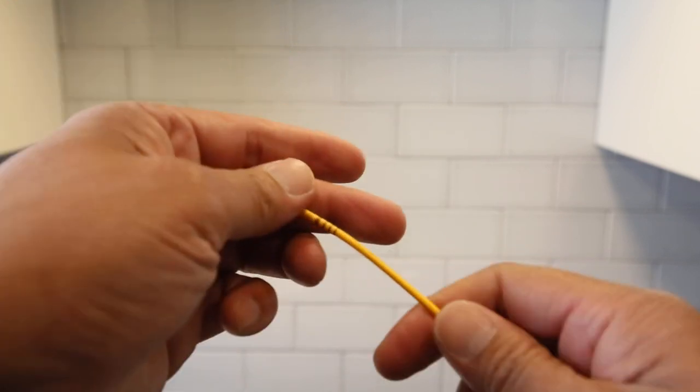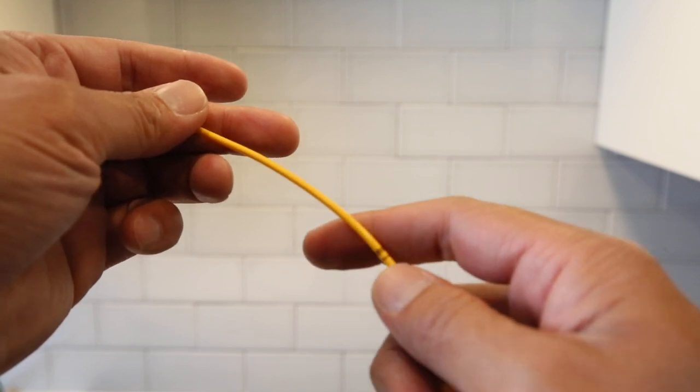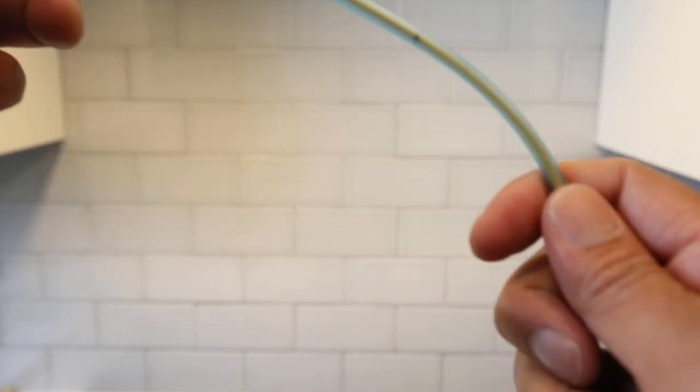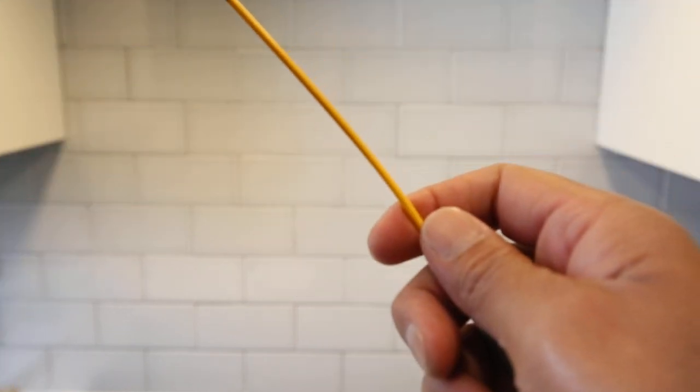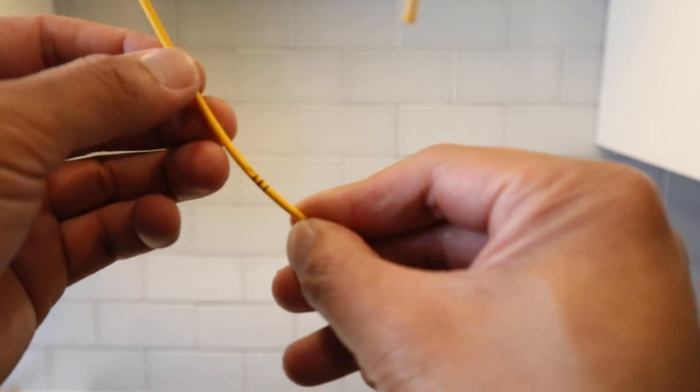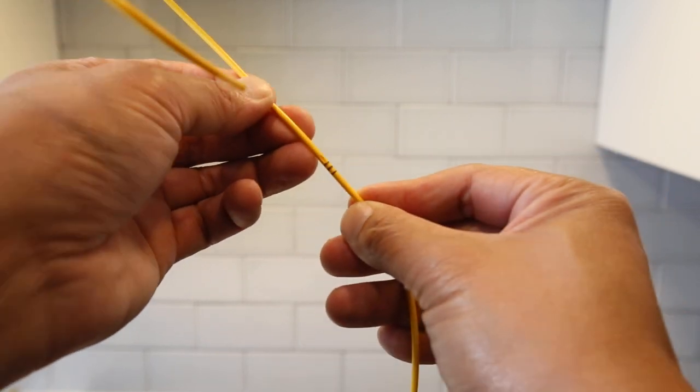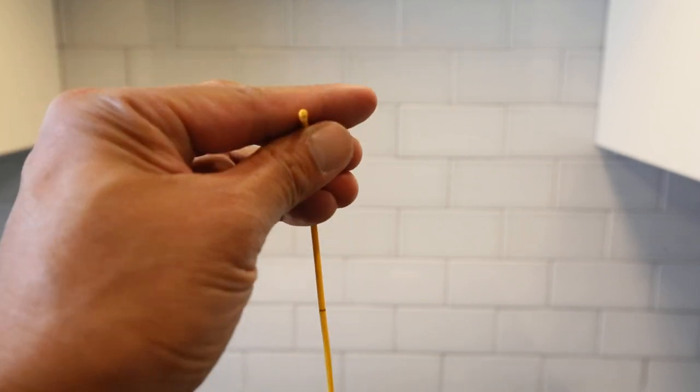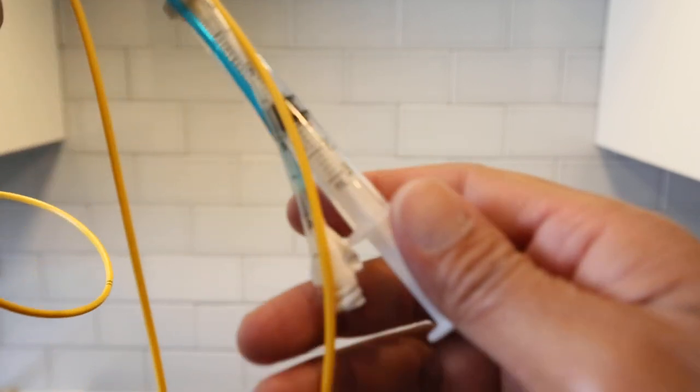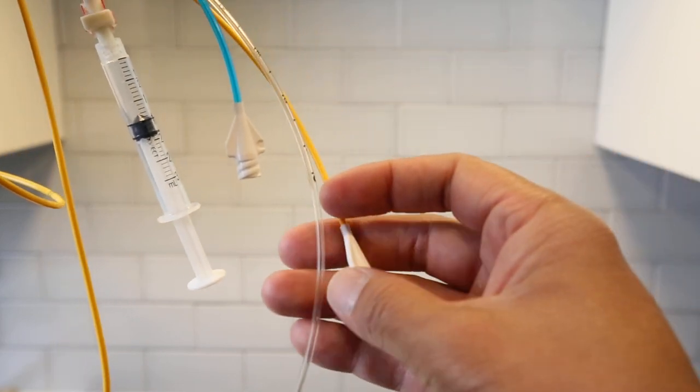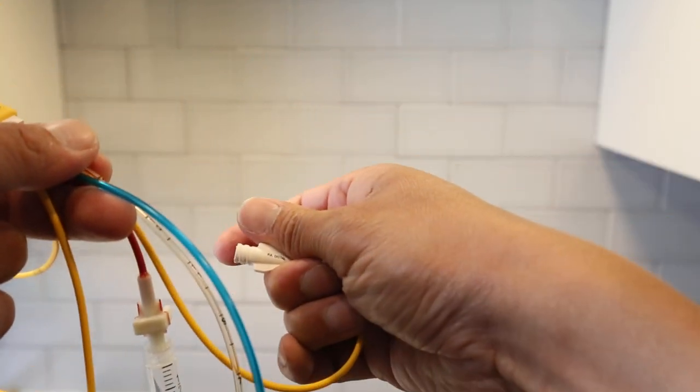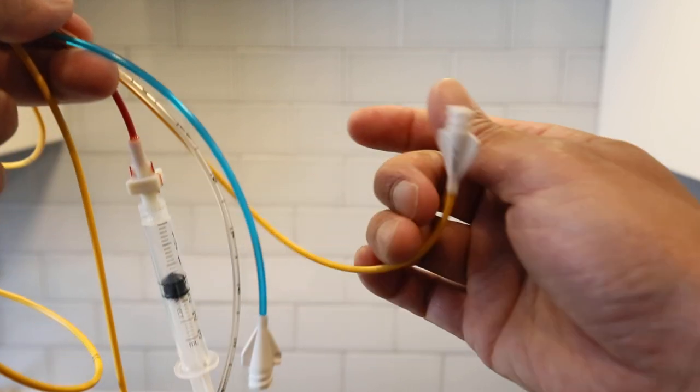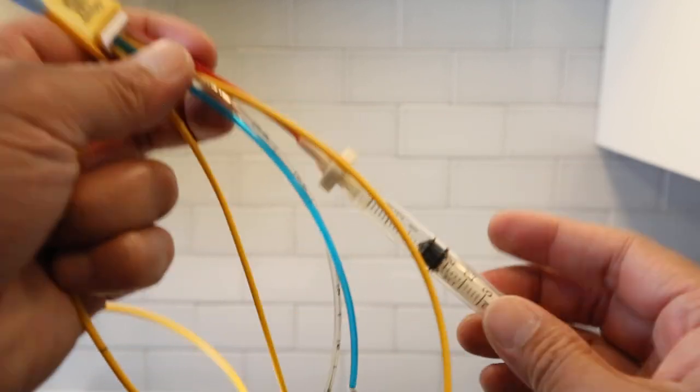So this proximal injectate will coincide with this one, hashtag three. And then this one will coincide with the distal lumen hub. So that would be this one. And now for the finale.